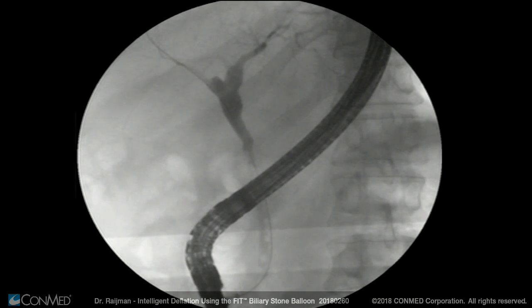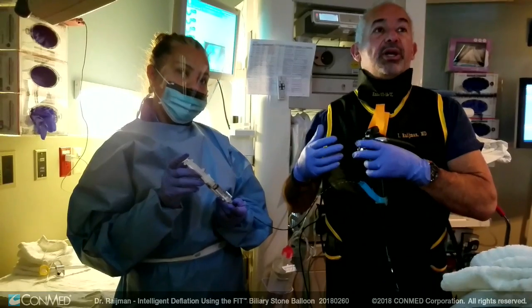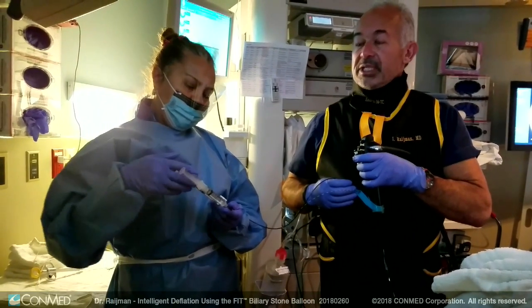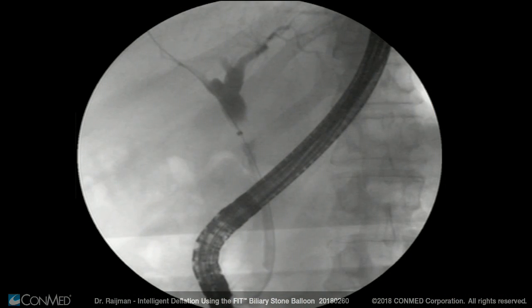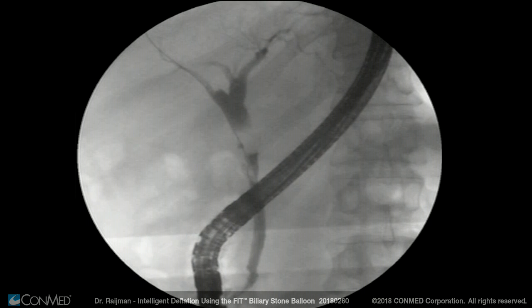At the same time, I engage the balloon enough against the distal duct to retrieve any debris or to estimate the caliber. I'll go ahead and put in one cc, and then I am going to demonstrate the advantage of the balloon sweep with the balloon in the unlocked position.